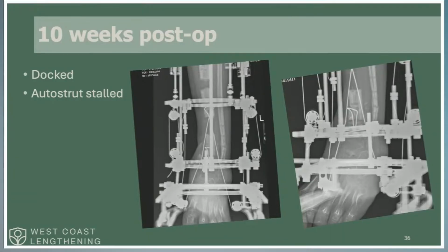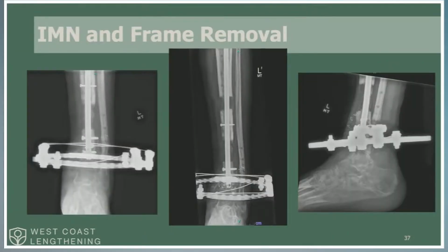And I'll leave them compressed for a little bit. I was a little nervous just because of his docking site, and this is one of the earlier cases I did. So I put some tension wires over the remaining one after I nailed. Stabilized the intercalary segment here through a custom screw hole, and here just through the distal interlock.